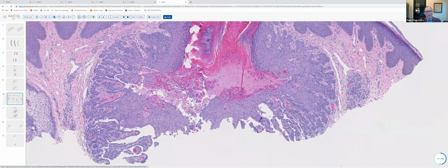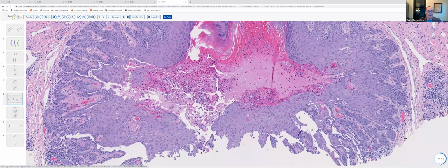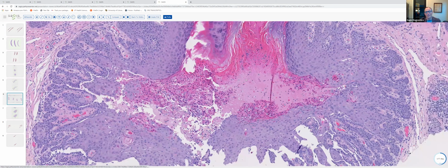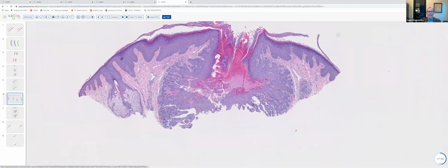When we look along the luminal aspect of this invagination, we see the epidermal reaction pattern of FAD, focal acantholytic dyskeratosis, with clefting, a lot of acantholytic cells, and pronounced dyskeratosis involving most of the cells in the central portion of this lesion. And again, it's best to think of warty dyskeratoma as either a dilated cyst, a dilated follicle, or a ductal structure showing the epidermal reaction pattern of FAD.